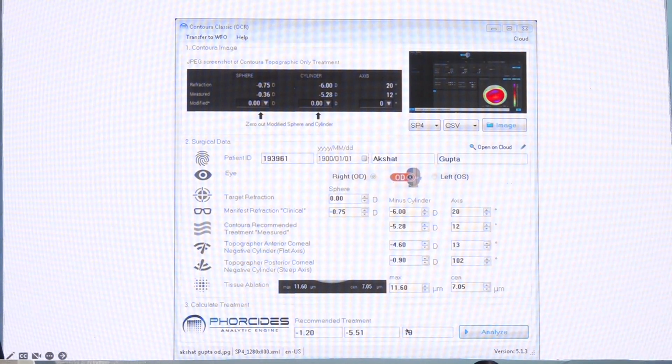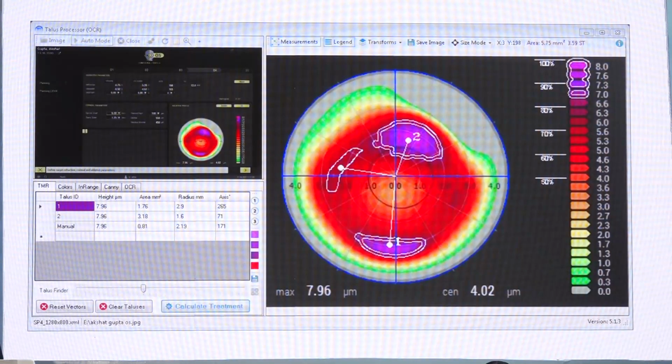And these work really well. We've been doing it for about 4-5 years. Contoura tends to really give well. And when it doesn't work, it tells you, don't do a Contoura here at all. It tells you to go do a wavefront optimized, and it really makes life much easier.